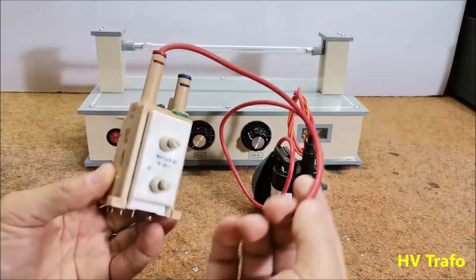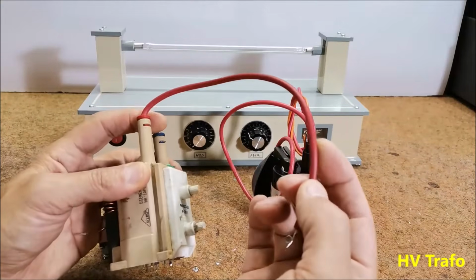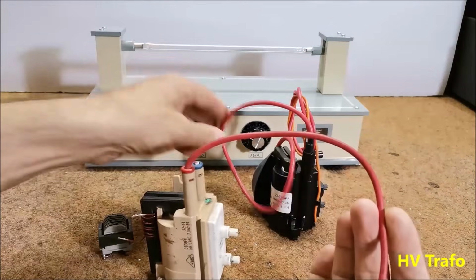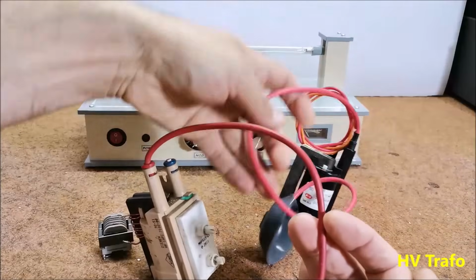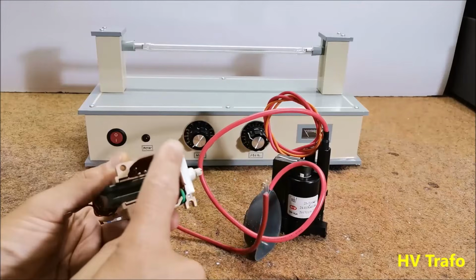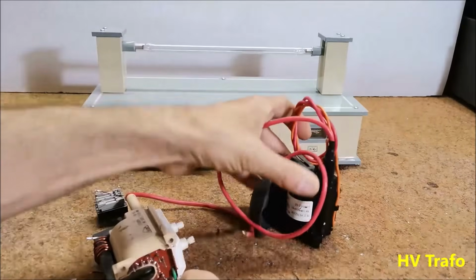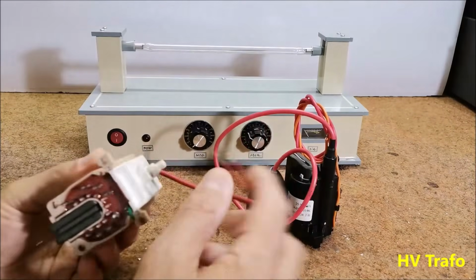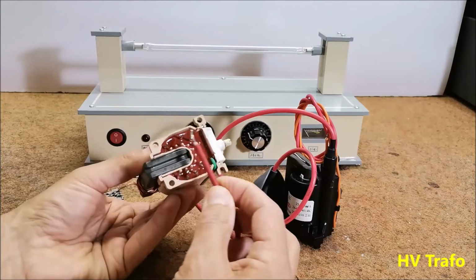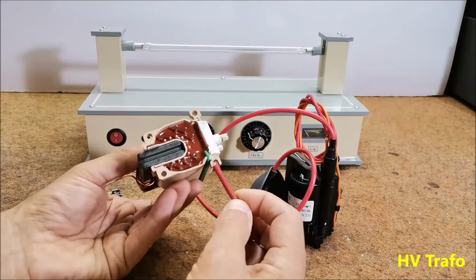The outputs of the high voltage transformer are connected directly to the plasma tube. In this transformer, the output is this big insulated wire, or this one on this transformer, and the ground, which is one of these pins. It can be tested in such a way that when we turn on the circuit and bring the electrode close to the pins, a spark of several centimeters will form at the correct ground pin.